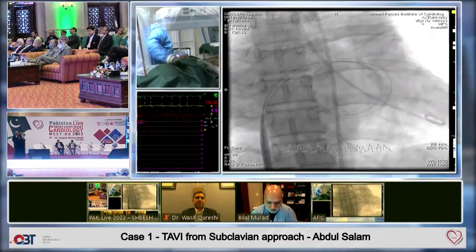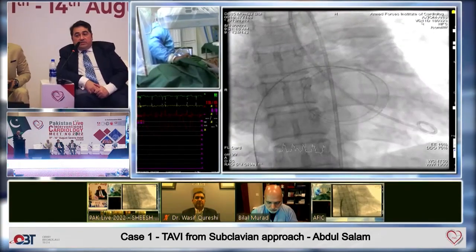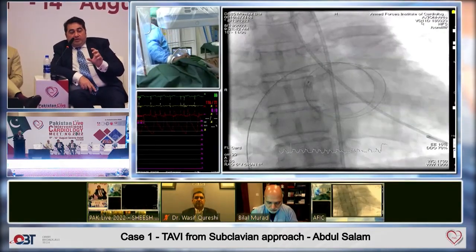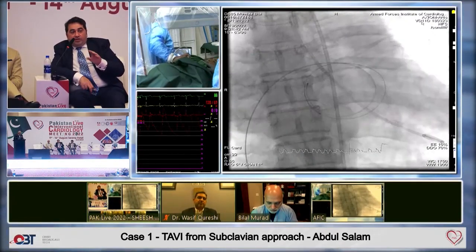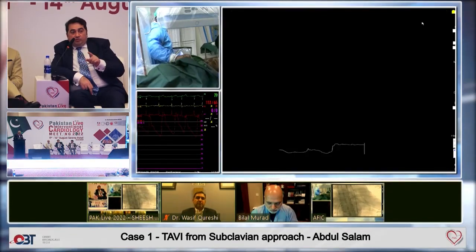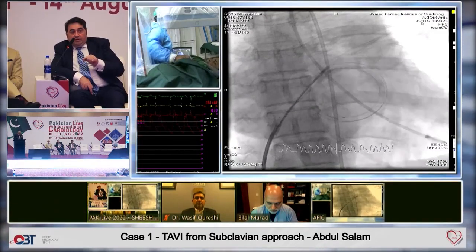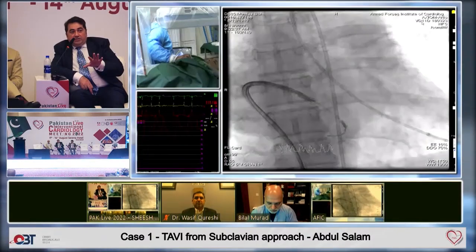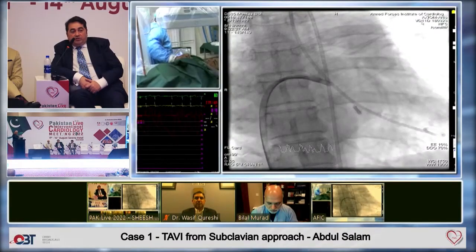Again, as mentioned by everyone, you have to look at the benefits and the risks as well. In this case, Asad did perfectly well, and he left it in the end because there was a very big chunk of calcium there. Although it's a 0 millimeter depth, if you want to get rid of the PVL, you will have to post-dilate more, and with Evolut there is a 1:100 pop-up rate with post-dilatation if it's a very high 0 millimeter valve. So PVL between mild to moderate, considering very high calcium, I leave it. And it does improve over the next 3 months with the nitinol nature of it.